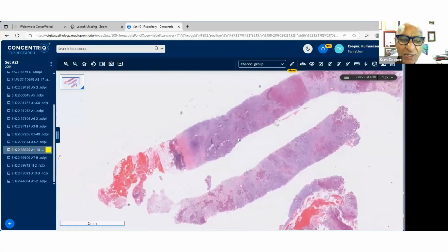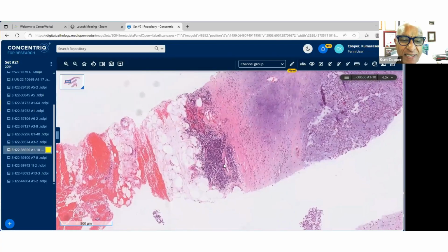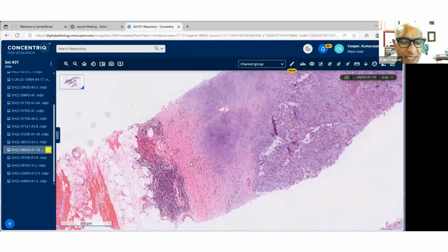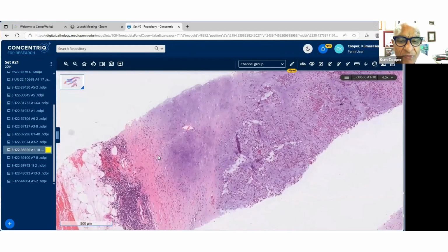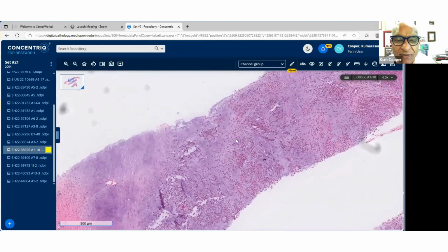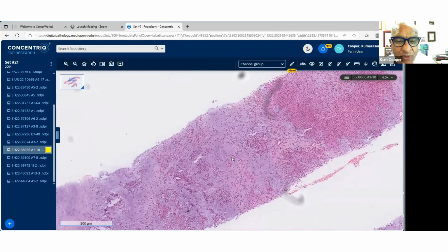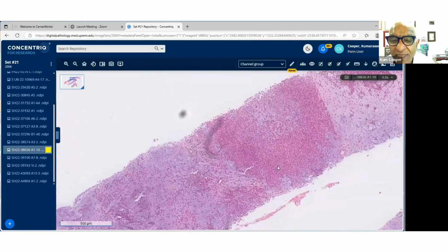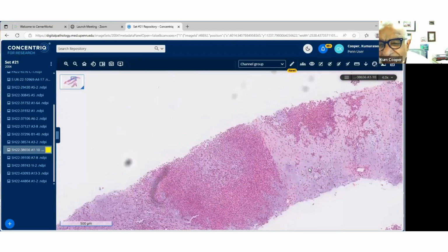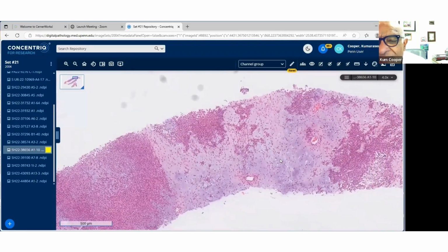So again, I'm just going to take you through the morphology. Fat and blood, mature fat, some lymphoid tissue around it. You can see the pseudocapsule, fairly well circumscribed, and the tumor looks pretty much the same. I'm just going to give you an overview on low power. You can see the stroma here where there are fewer cells, but other areas where there are much more cells, much more cellular. You can compare and contrast these more hypercellular with less cellular areas here as well.